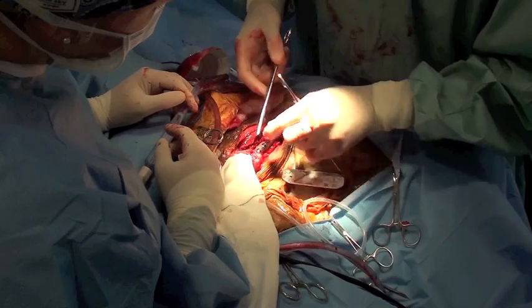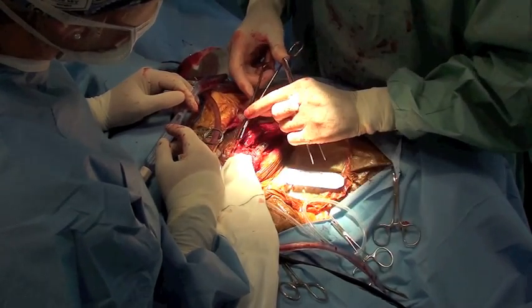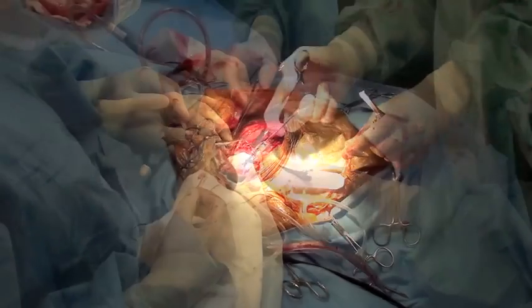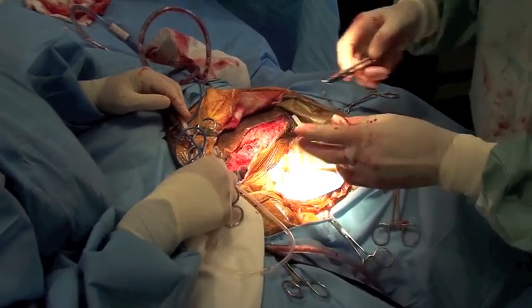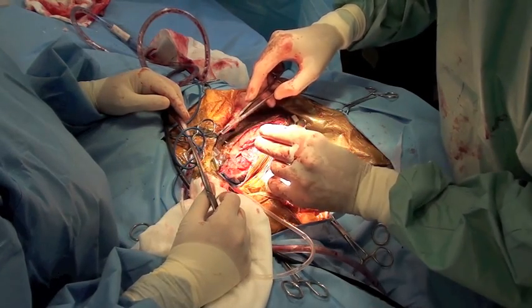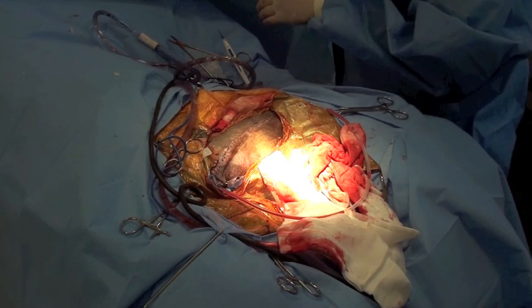Muscle bellies are reconstructed using 2-0 PDS in a simple continuous pattern. Subcutaneous and subcuticular layers are closed with 2-0 PDS in a simple continuous pattern. This patient was to receive two more doses of radiation therapy two and three weeks after the initial surgery.